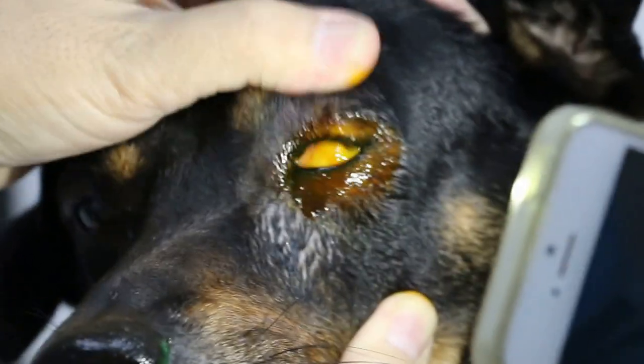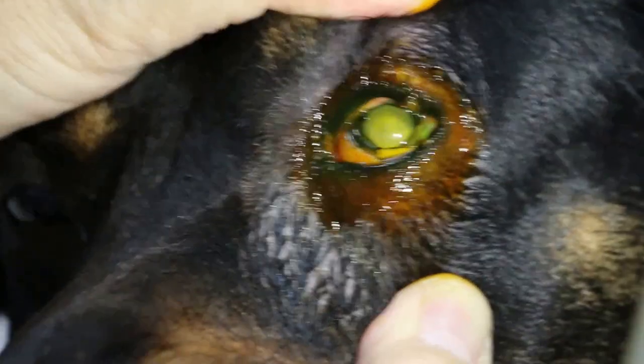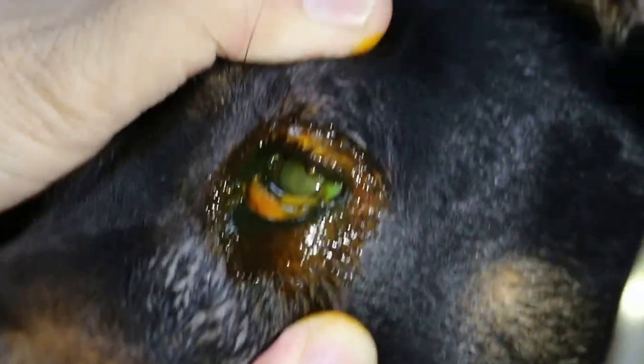It's not so swollen. We put a fluorescent stain to see whether it's a ulcer or not. How old is the dog? Around 7. So it's probably injured — something dropped into the eye or the lower part.